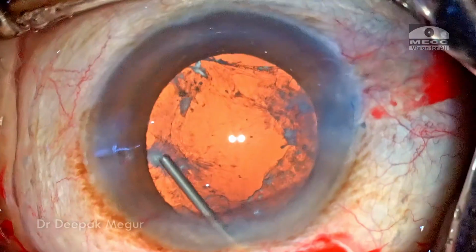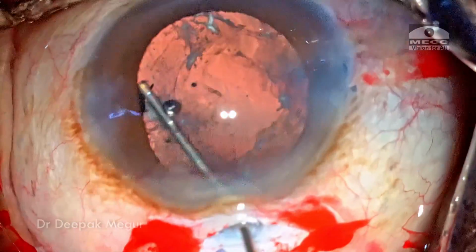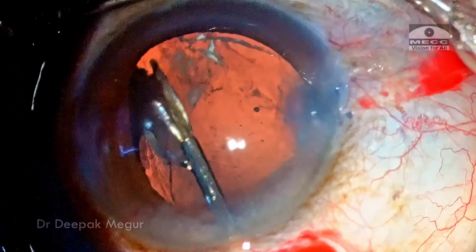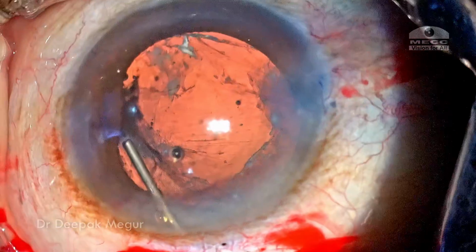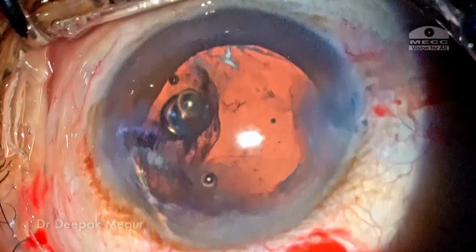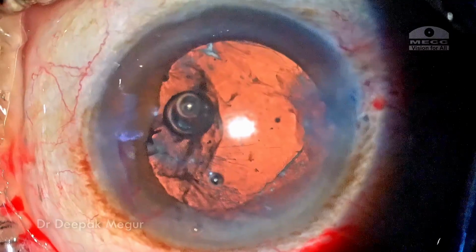Before putting in the lens, I need to deal with this posterior synechiae where part of the iris in one quadrant is sticking onto the flimsy anterior capsule. So I'm using micro scissors to cut the adhesion, and then again I'm ensuring that it is totally free by injecting cohesive OVD. And now things look to be alright, and there looks to be enough space to manipulate the multi-piece lens in.